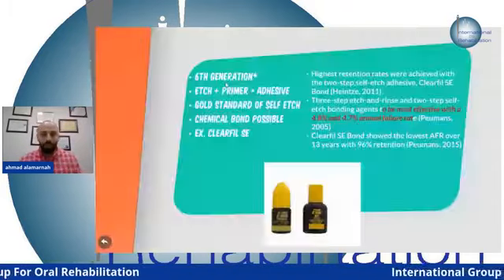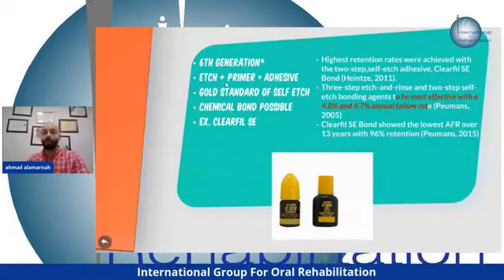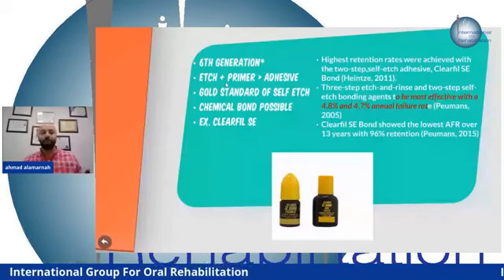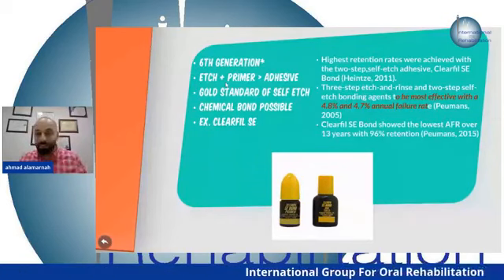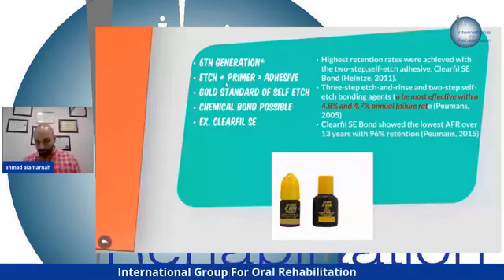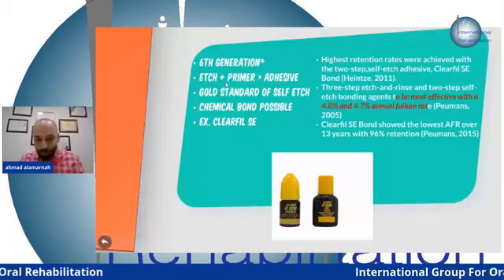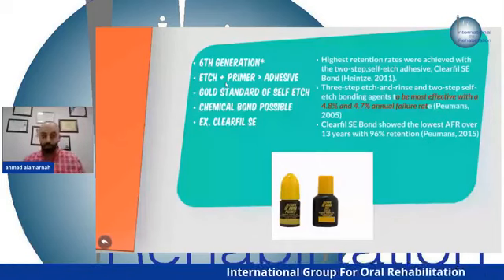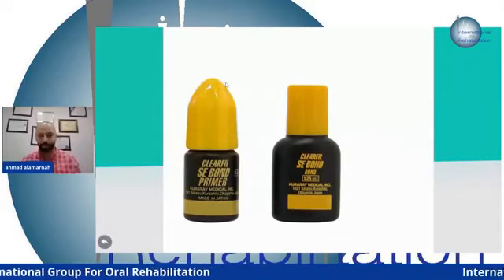Another one, the 6th generation, as we said before, the etch and the prime in one bottle and the adhesive in the other bottle. They have a 96% retention after 13 years. This is from a company called Kuraray. This is the ultimate bond in my opinion.